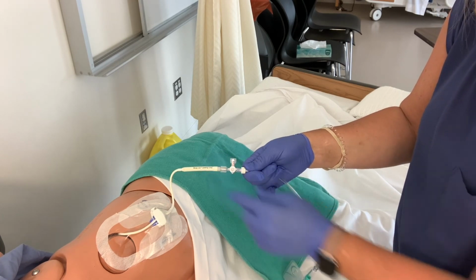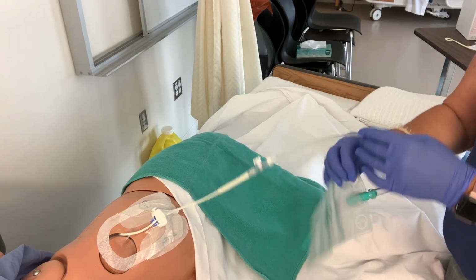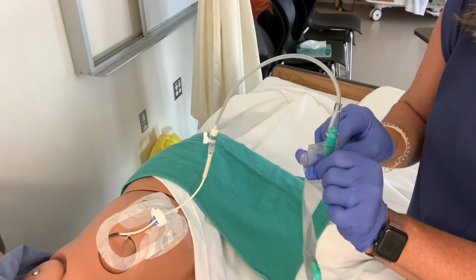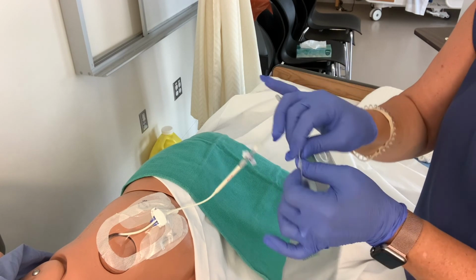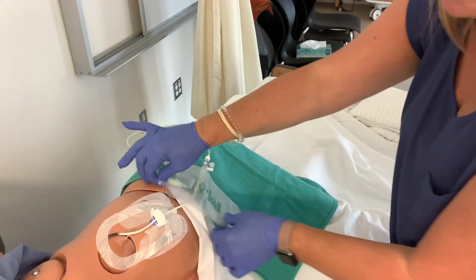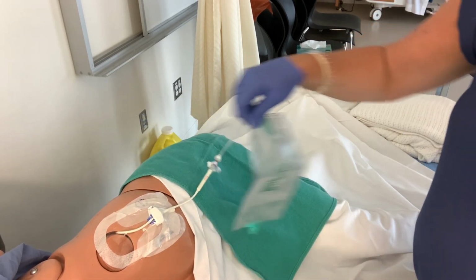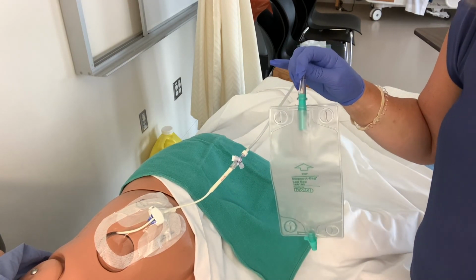So I have opened it to my patient. It is now able to free flow into the patient's bag, which I'm going to empty at the end of my shift and record in the ins and outs. There's little slits here that would be used to put around his leg, but typically we'll take a safety pin and pin it to the shirt so that the weight of the bag does not pull on the tubing, okay? And that's care of a percutaneous drain in a variety of locations.